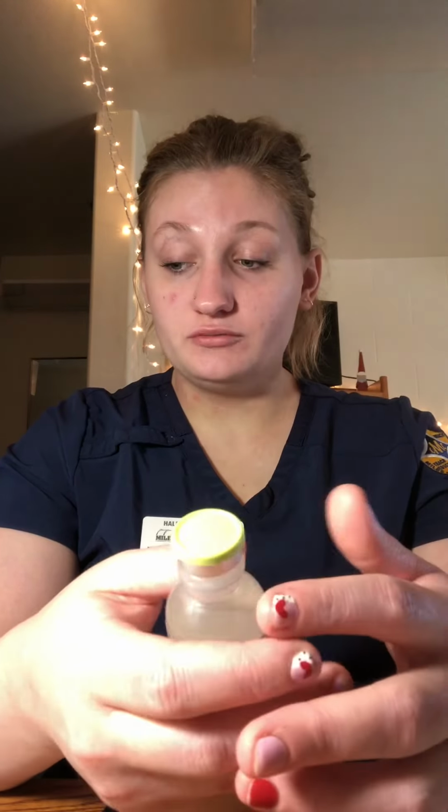Okay, and then we gotta check the vial. It's unopened. Check for any cracks, the expiration date, anything that does not look safe to give or abnormal. If it's a multi-dose, then you have to look for the time and date and initials of the nurse on the vial.